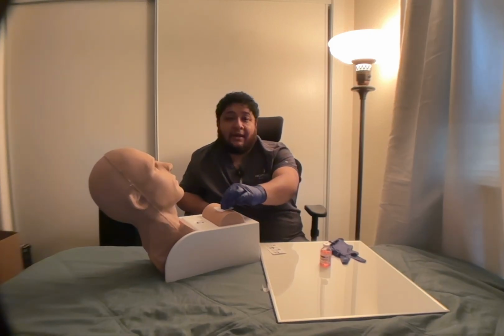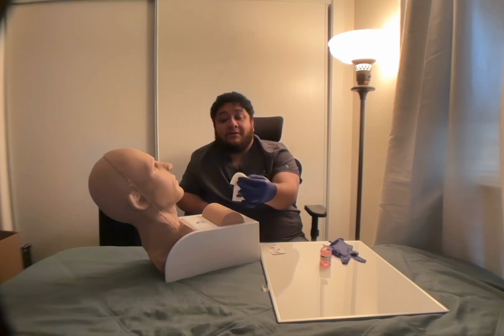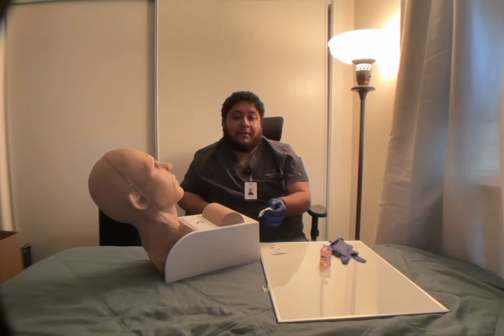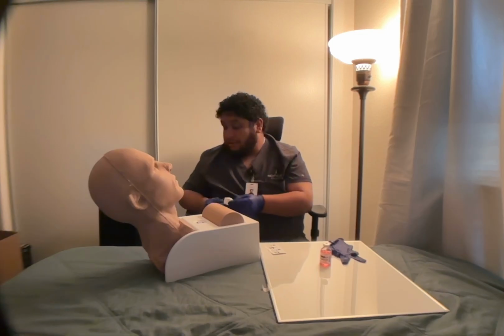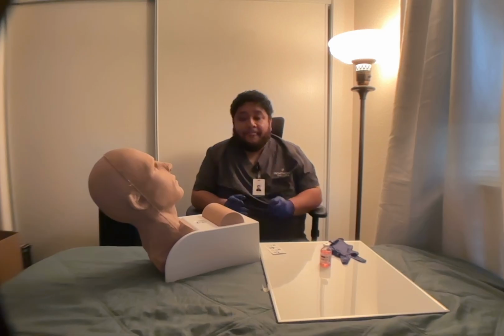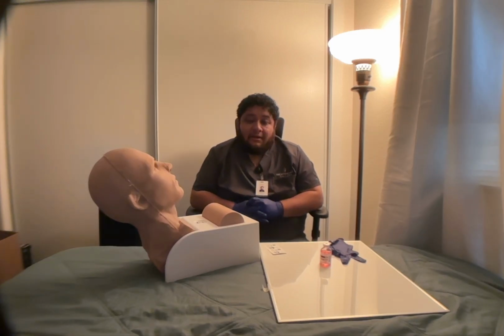Now you're going to check if there's any blood coming out of the injection site. You want to apply a bandage, but there's none. So now I'm just going to discard this, and my patient does not need a bandage anymore. First of all, you don't recap a used needle, just to let you know.